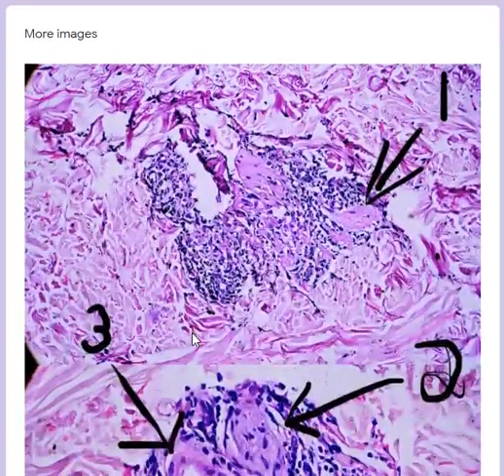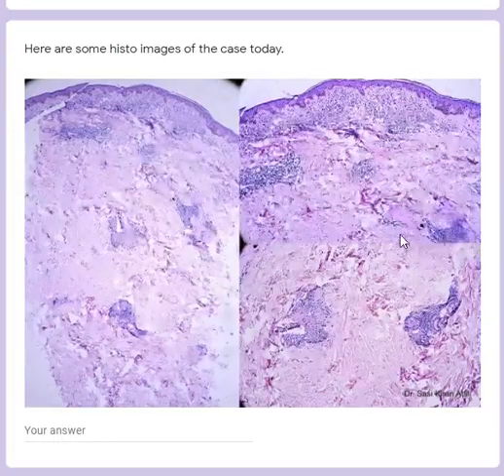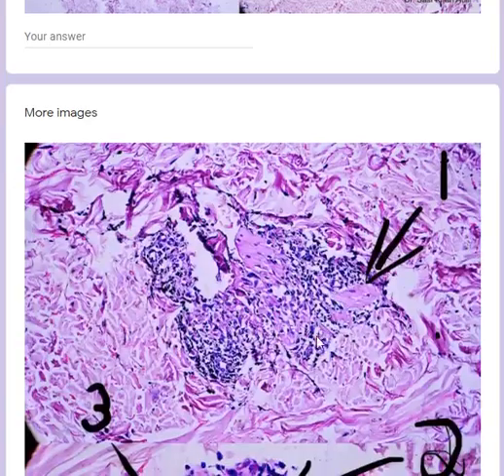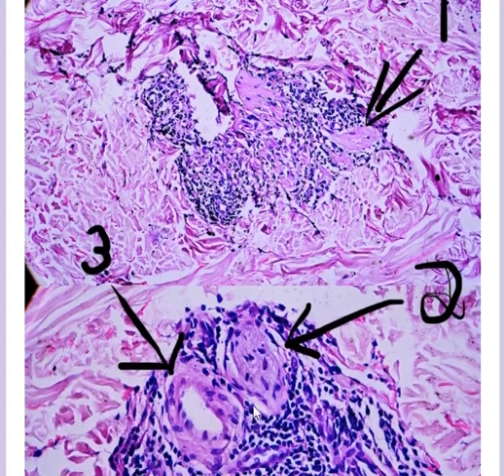So what other characteristics does it have? Now, as I told you, this is a close-up of this sort of area here, and this is a muscle cell. And muscle cells are different from nerve cells, which is what it is here. This nerve cell is trapped along with the eccrine gland. Okay. Now, eccrine glands are quite deep, and so is a nerve fiber. If you're looking for perineural infiltration in Hansen's, this is where you need to look at. You need to look deep in the dermis.